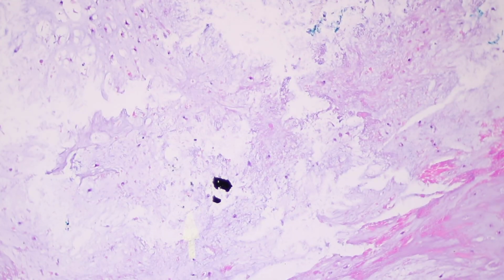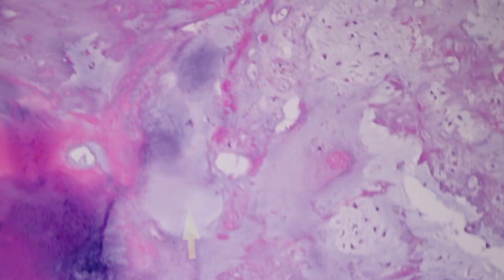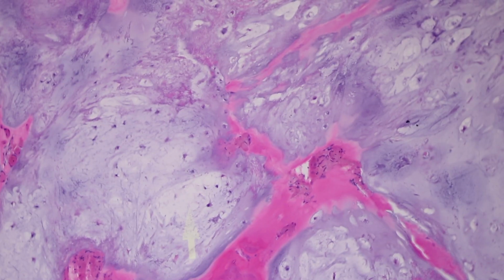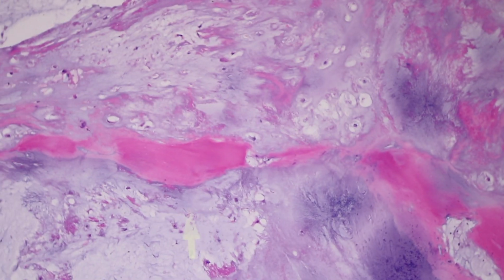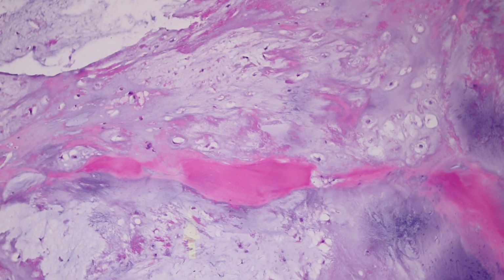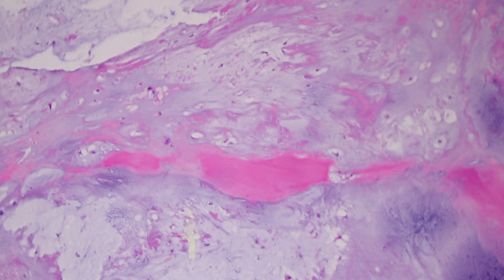So here we have an area. One of the things I struggle with sometimes is deciding what's mineralized cartilage versus entrapped true background trabecular bone. I mean, do I look for the lamellar change to help identify what's a true bone?